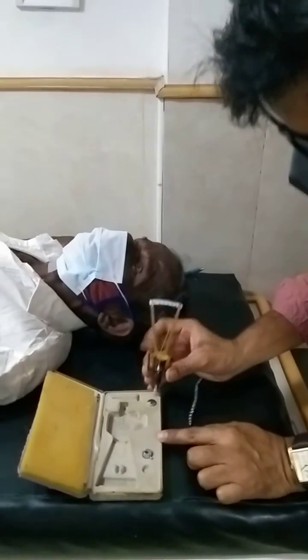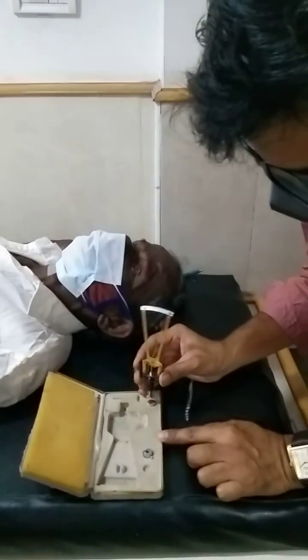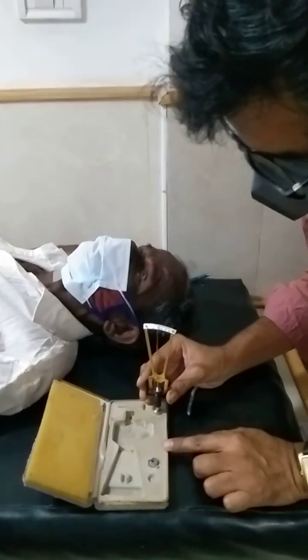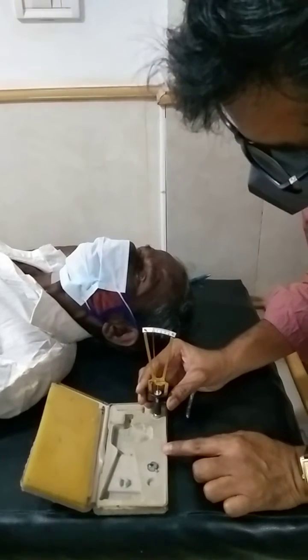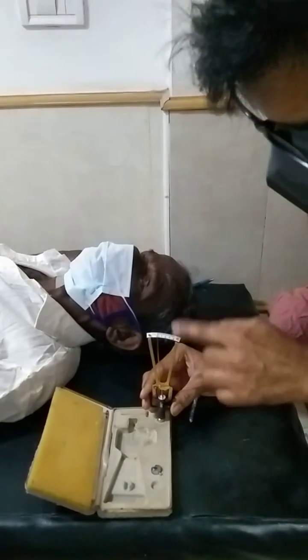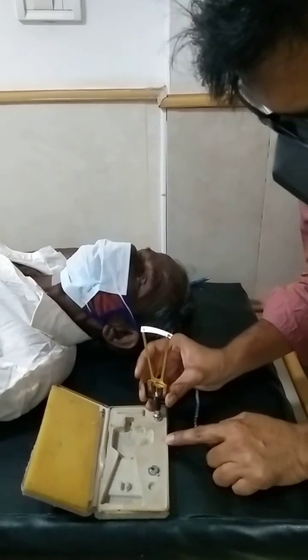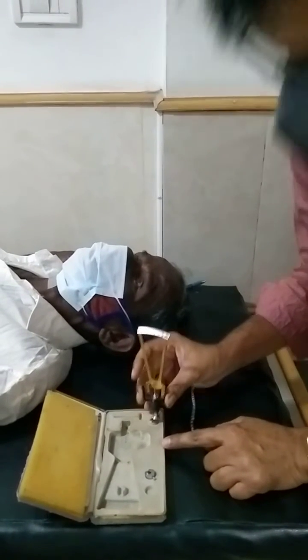Now the next step is to check that this instrument is properly calibrated — we have to put it in this dummy cornea and check that if this needle is coming to 0, that means the instrument is proper. If it is not at 0, then we have to clean it again.